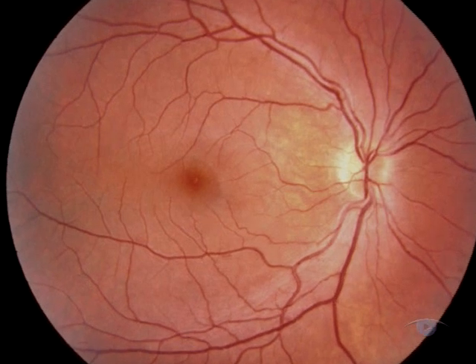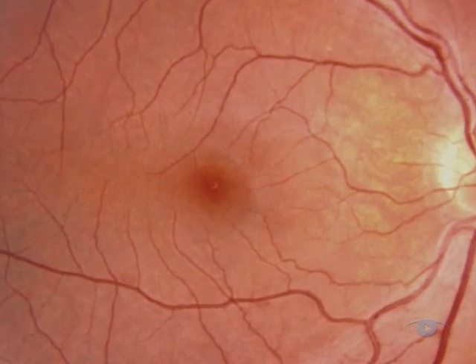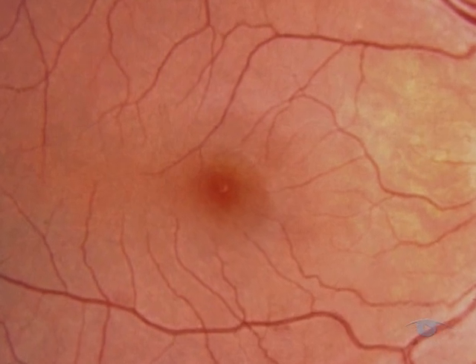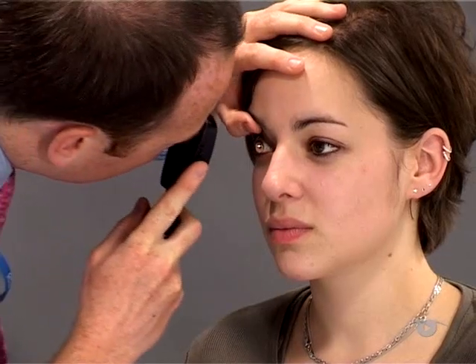As the final part of fundoscopy, you should examine the central retina lying inside the vascular arcades. It contains the macular region and the centrally located fovea. To bring the fovea into view, simply ask the patient to look directly at your light. Some patients will find this difficult to tolerate, which is why it is best left until last.